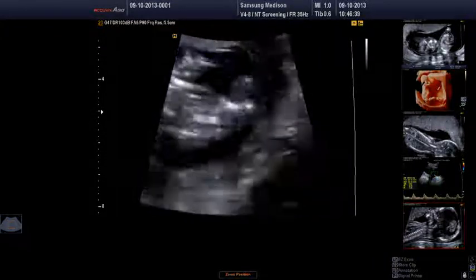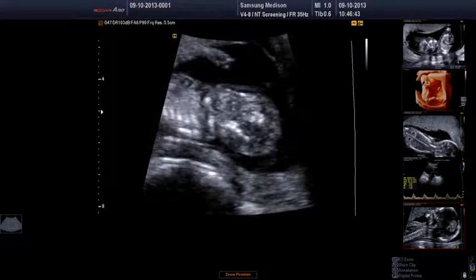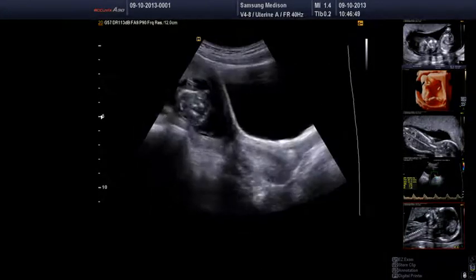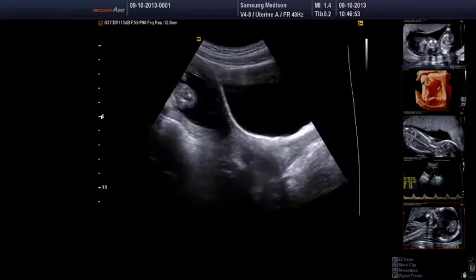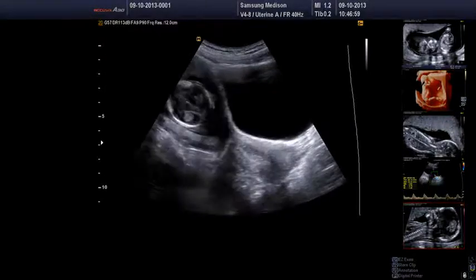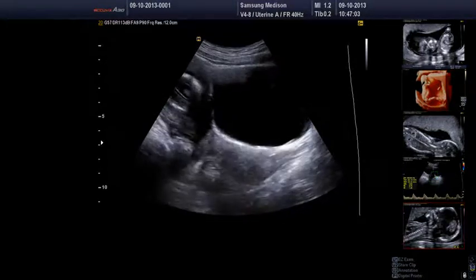Okay, so we might just switch away from looking at the fetus for a moment and just look at the Dopplers. We've been talking a bit during the course of the last few days about other features that we might look at on a scan. You can see that the bladder's now quite full, and we can see the cervix quite clearly, but in reality, the length of the cervix now gets expanded by filling of the bladder.